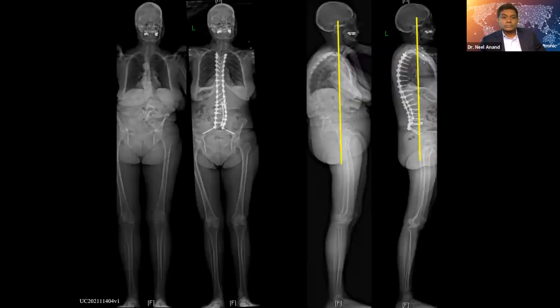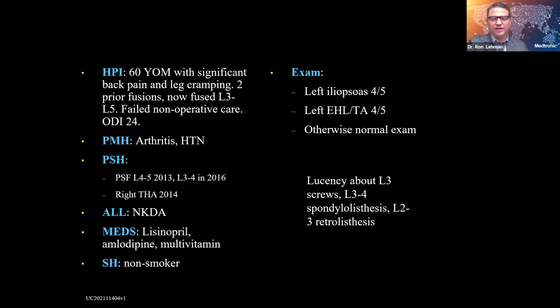Sagittal plane profile, I think we improved this quite a bit as well. And certainly when we look at that, we maintain some harmonious balance of the thoracic kyphosis and the lumbar lordosis, and her gravity line we once again put in place and make sure that ultimately we balance her. And once again, this is all from a posterior approach, something that we know how to do. The question really is ultimately, how do we achieve our correction?